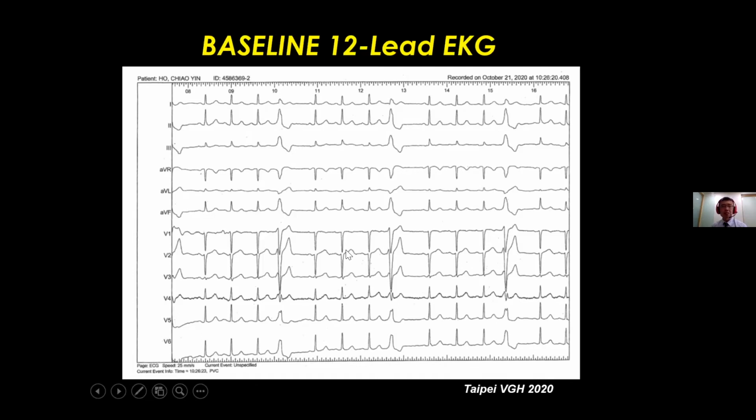If the sinus rhythm transition is earlier and the PVC transition is later compared to sinus rhythm, we will have a positive transition score. If that is positive, it is highly possible to be coming from the right side RVOT. If that is negative, then you may need to search the left side. Another is the V2 transition ratio. For the first step, you also need to see the transition area of the PVC. If that is early, around V2 to V3, then we will use the formula to calculate the transition ratio.